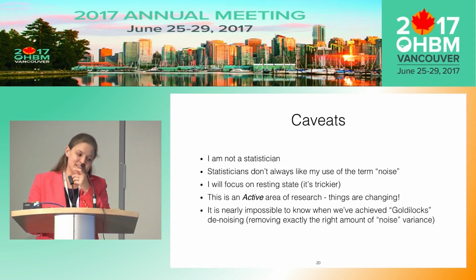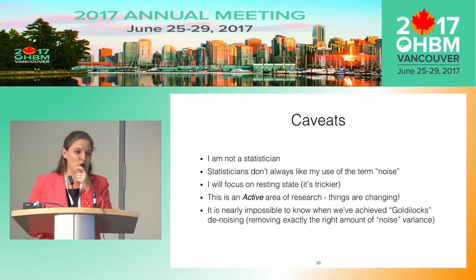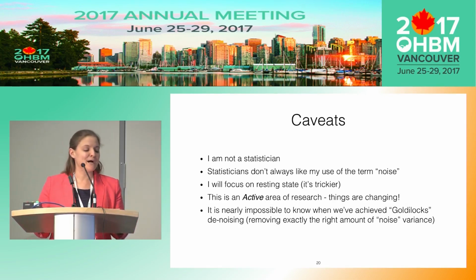It's nearly impossible to know when we've done just the right amount of denoising, this Goldilocks denoising, not too much, not too little, just right. And I'm not going to be able to tell you at all how you know that you're in this situation. It's a spectrum. So all we can really do is build confidence that at least we're doing the denoising approach in a really statistically valid way.